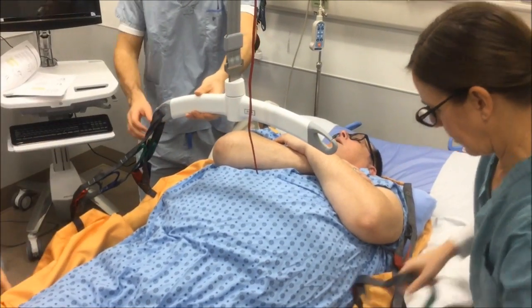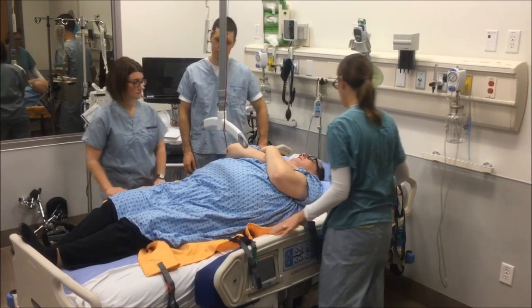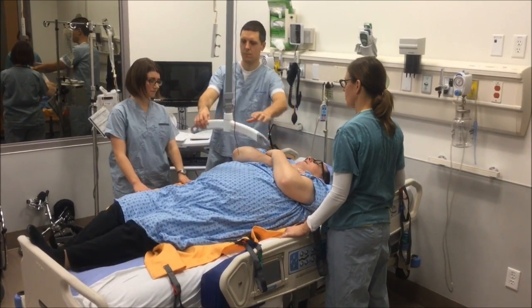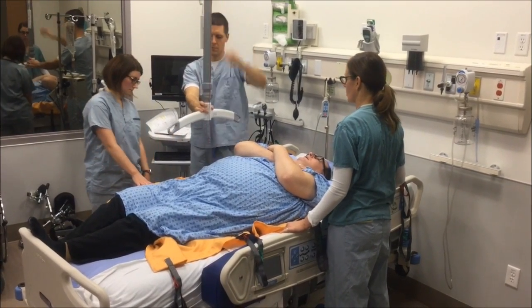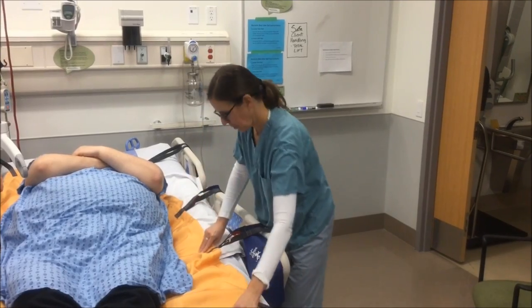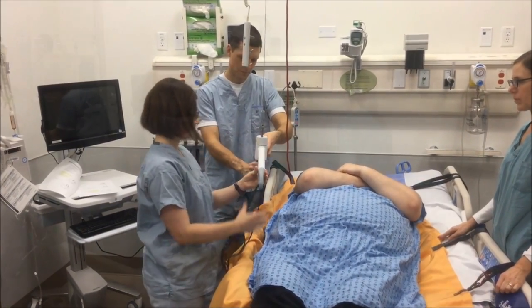Now we are going to show how to log roll using the repositioning sling and lift. If needed, support the client's abdomen with the draw sheet or abdominal binder to manage unexpected shifts in client weight. Place the bed rails up on the side the client is being turned toward. Position the spreader bar parallel to the edge of the bed. Adjust the position of the spreader bar and or the bed height to make the sling attachment easier. The worker on the side the client is being turned toward ensures the sling is aligned with the edge of the bed. The worker on the other side attaches the 2 middle straps of the sling to the spreader bar.